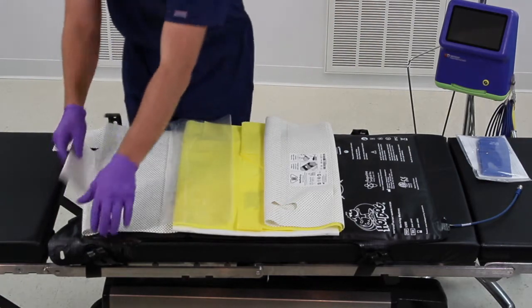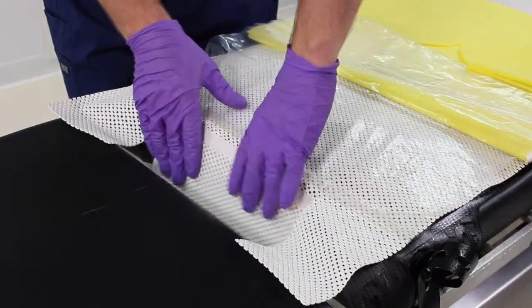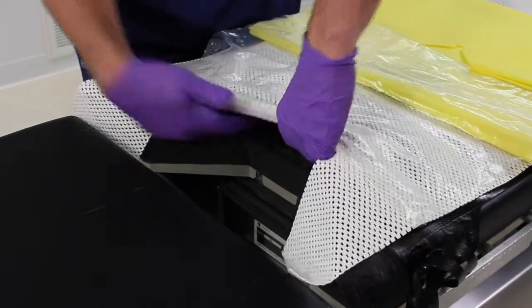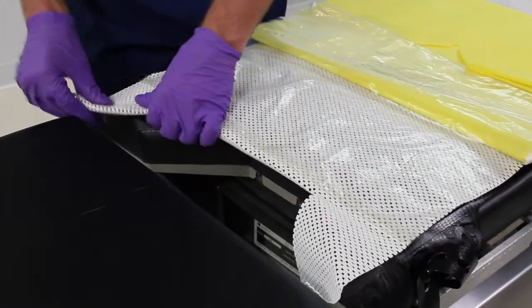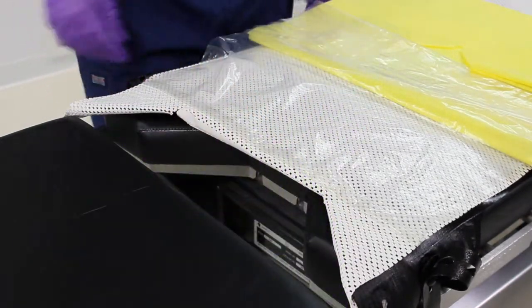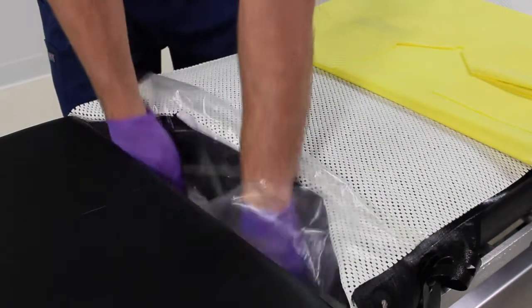Unfold the waffle grip pad over the warming mattress and tuck the reinforced flap of the waffle grip pad under the warming mattress at the perineal cutout. This is very important because it anchors the pad to the warming mattress, which is secured to the operating table. Cover the perineal cutout with the perineal drape to prevent fluids from leaking under the warming mattress.